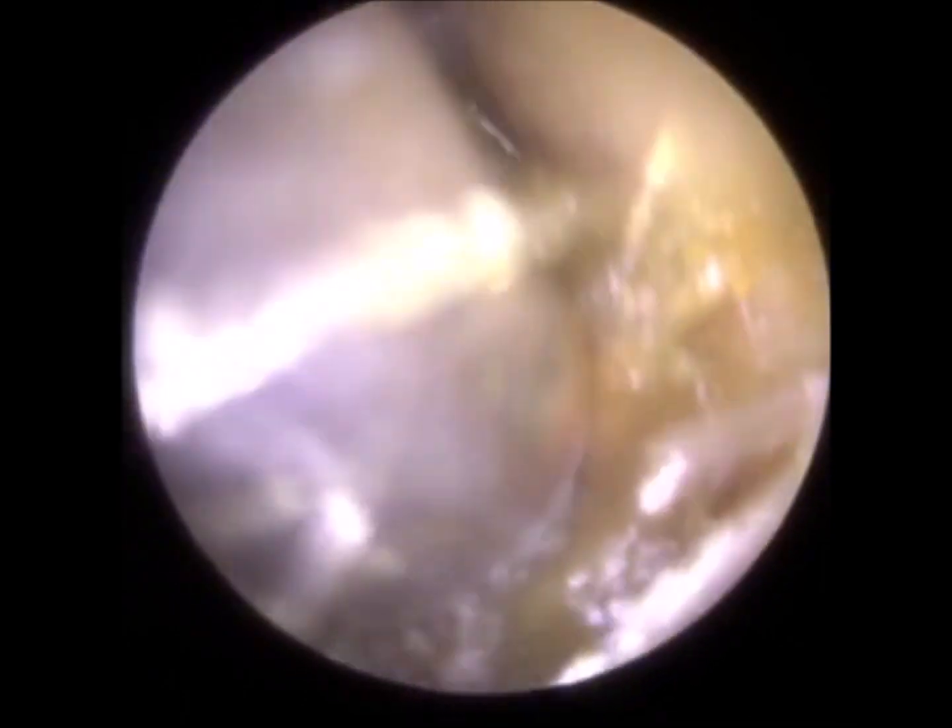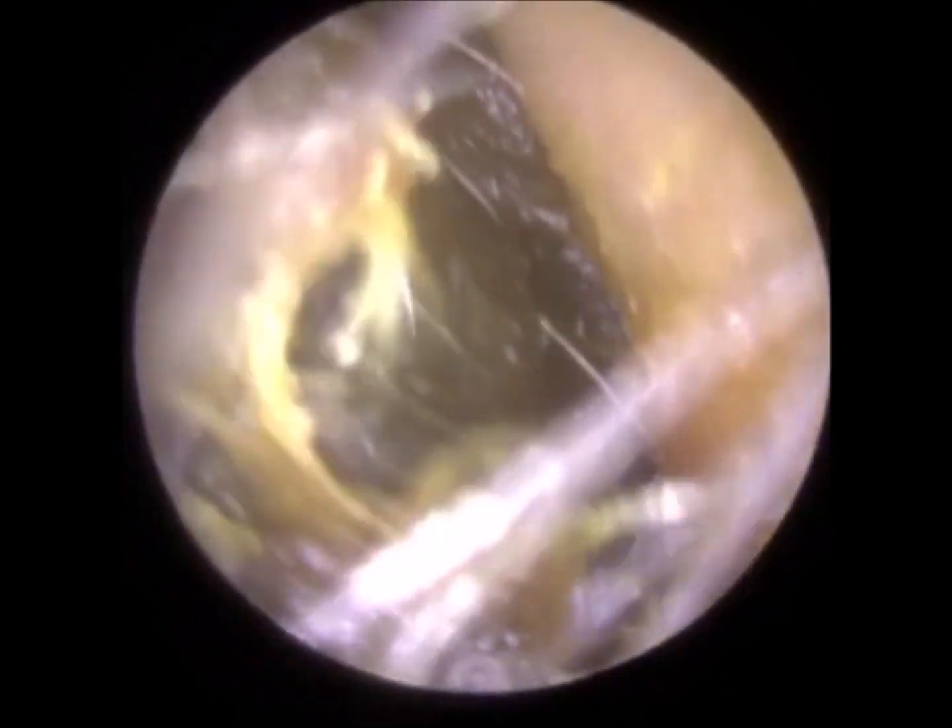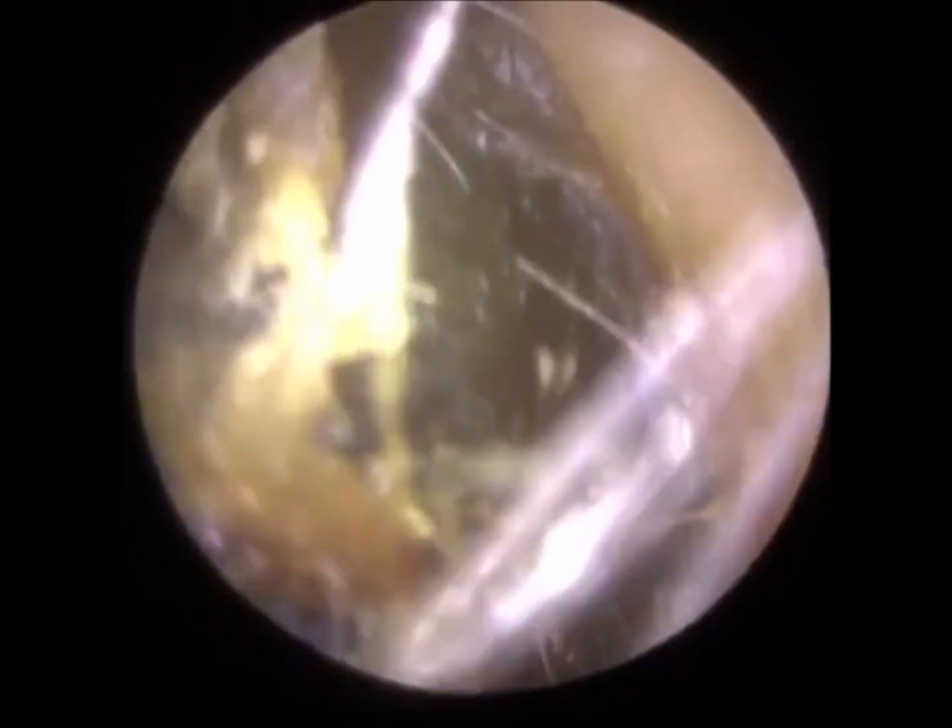Moving to the right side — this is the better ear of the two, not as occluding. We started off with the Zolnir suction probe, but you'll see here the wax is a bit glutinous and a bit matted as well. However, it's actually a bit firmer and more solid in consistency than the left one. The left side was a bit like soft poop — you'd go in with the jobson horn and it would just dissect. The right side has got a bit more texture, a bit more purchase, so it's a bit drier and not as loose, even though it's sticky.